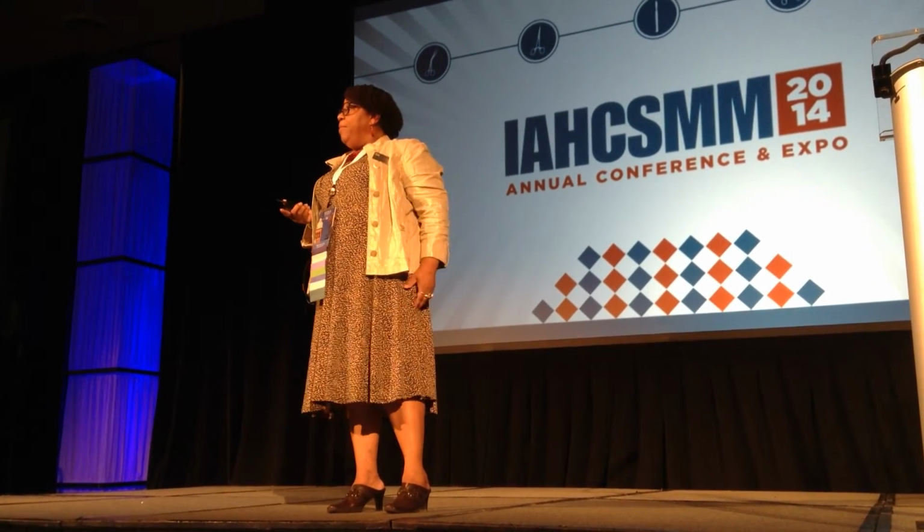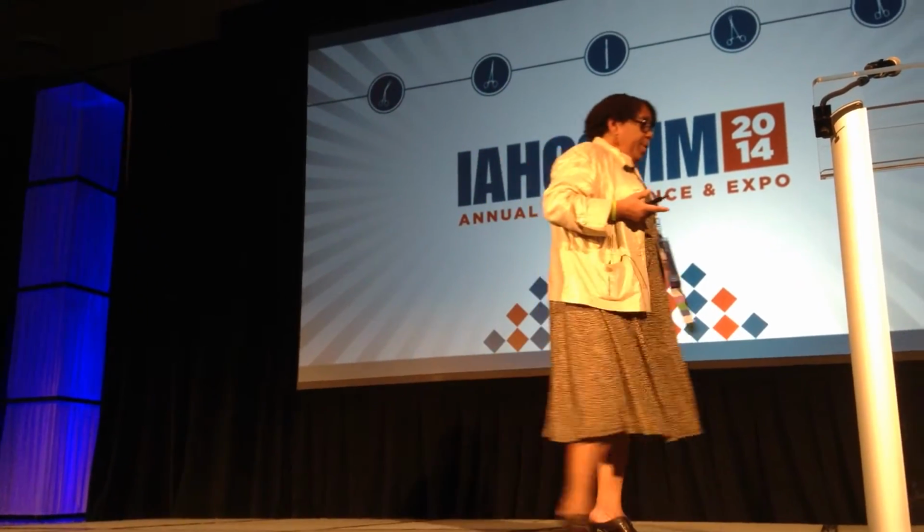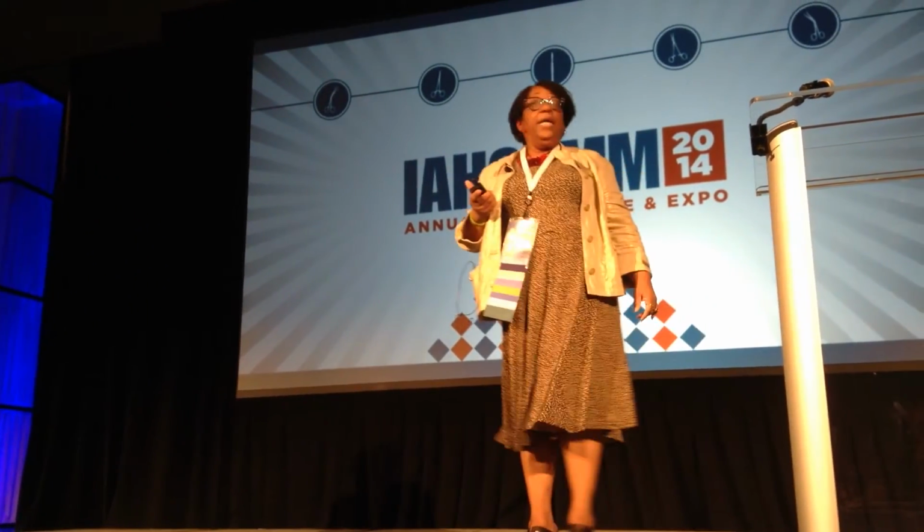My team members. But we have technology. They have a packing list that came in your tray. Guess where it was? And it had a big X that said there was no Maryland. And at my little hospital, we started this little process we're trying to help, where we put a little red dot on the luggage tag. So if it has a red dot, it means something's missing. So you turn the luggage tag over and it says Maryland missing.